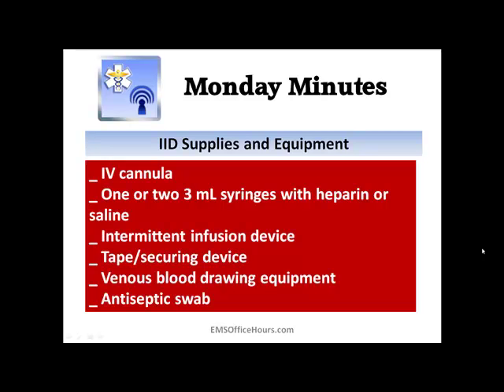You're going to have the device itself, which is that tubing that we just spoke about, and you're going to have tape or some sort of securing device to secure the IV down, right? Maybe you're doing the whole old school sort of tape down the IV. Maybe you've got that Veni-Guard going on there. Okay, whatever the case may be.